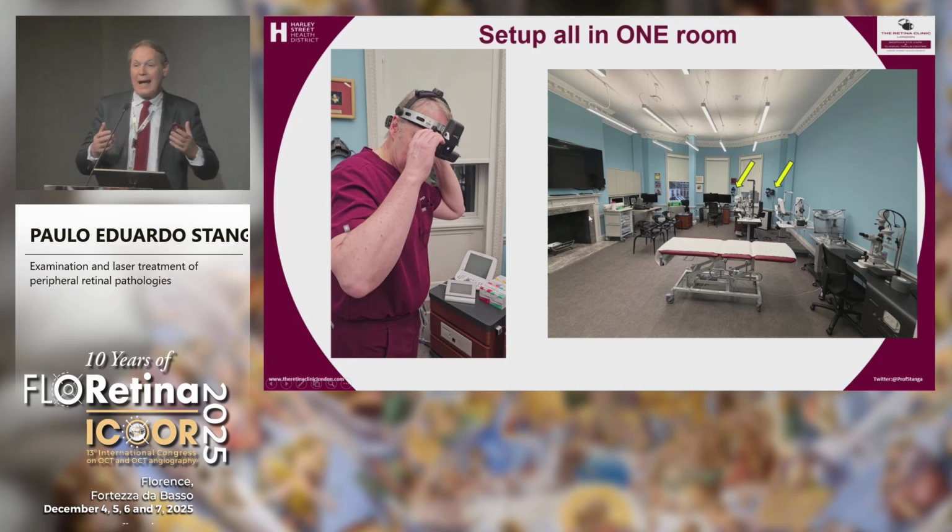Because this is the one I use, and I'm the only one using it in my office, I don't need to do this every time. This is set to the size of my head, a big head, as you can see, and the interpupillary distance, and it takes 2 seconds. The only thing I need to readjust is the height of the light, because that depends on what distance I'm examining a patient.